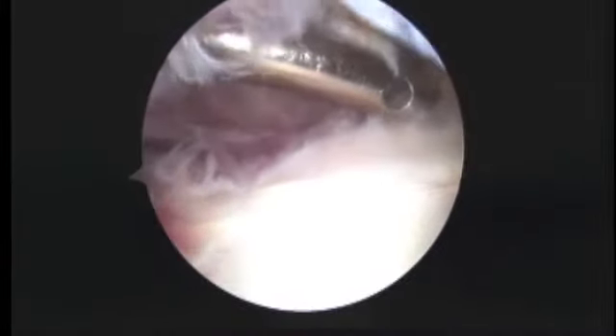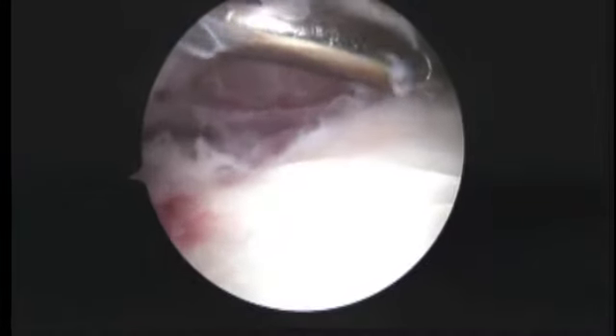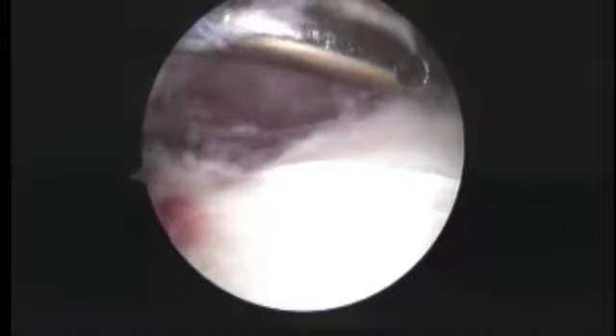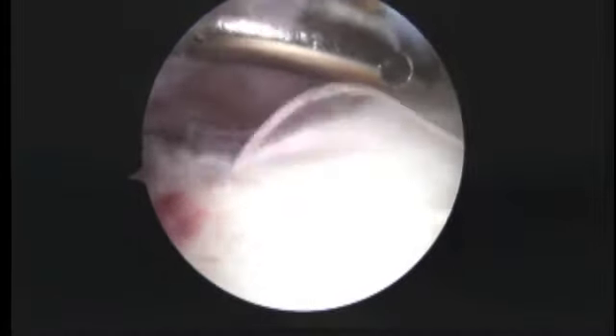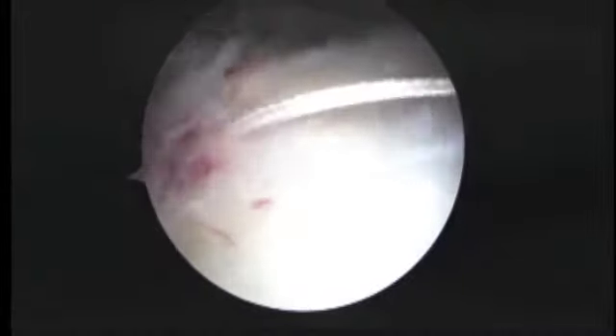Now we have the biceps secured. We are just about done. This is the final step — we're going to tie these biceps tenodesis sutures. We've already done a bit of a decompression to take off a little bit of a bone spur off of the acromion. Your rotator cuff looks fine from this side, so we do not have to do anything to the rotator cuff. Here we are tying the sutures for the biceps tenodesis.